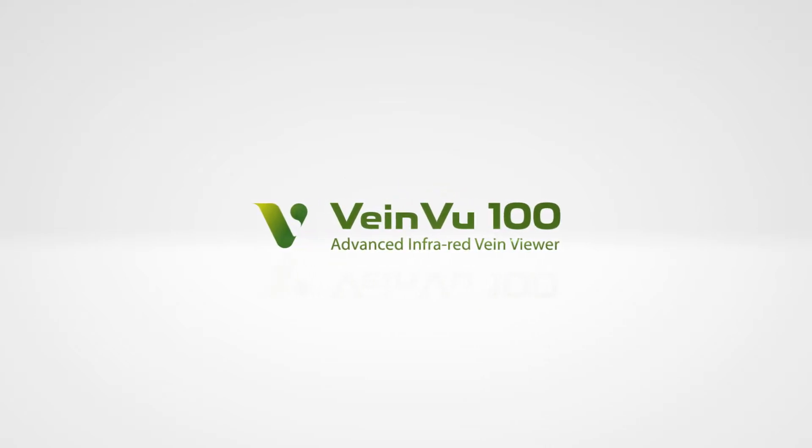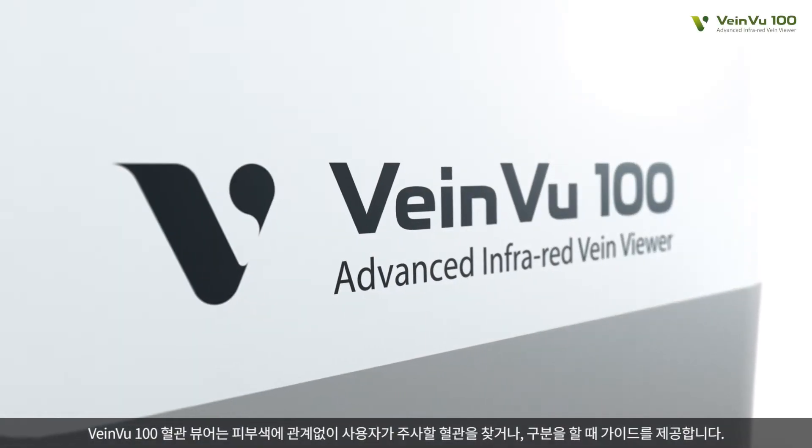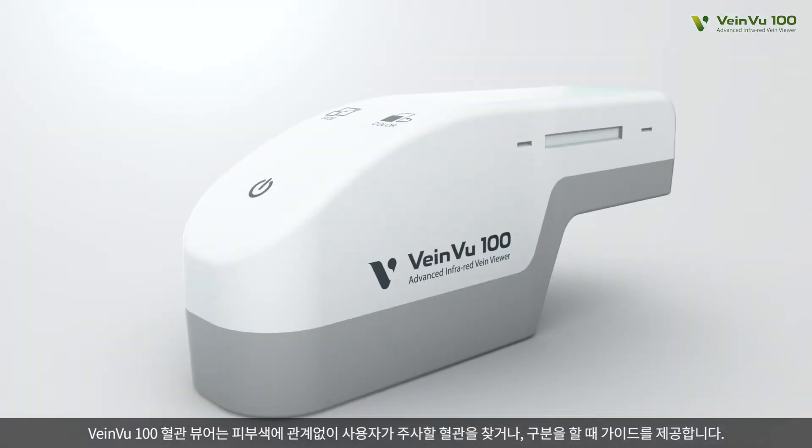Non-Contact Vein Viewer, VeinVu 100. VeinVu 100 Transilluminator guides users when they find or distinguish a vein to inject, regardless of skin colors.